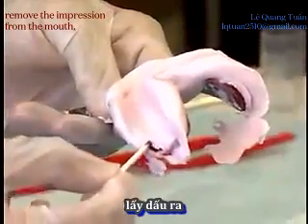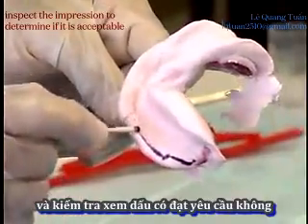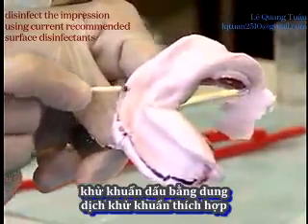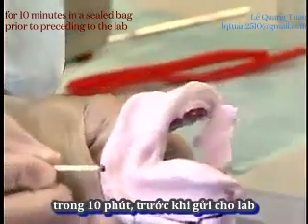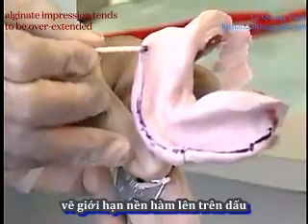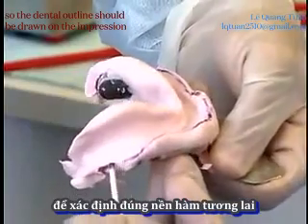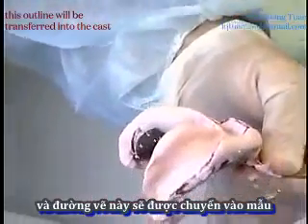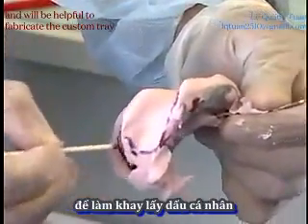Remove the impression from the mouth and inspect it to determine if it is acceptable. Disinfect the impression using the current recommended surface disinfectant for 10 minutes in a sealed bag prior to proceeding to the lab. Alginate impressions tend to be overextended, so the denture outline should be drawn on the impression with an indelible stick. This outline will be transferred to the cast and will be helpful in fabricating the custom tray.